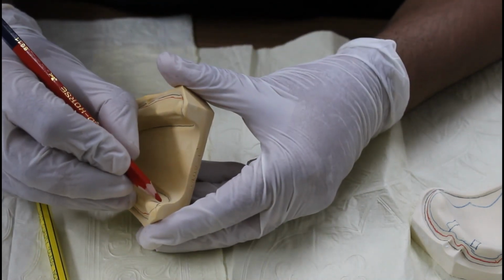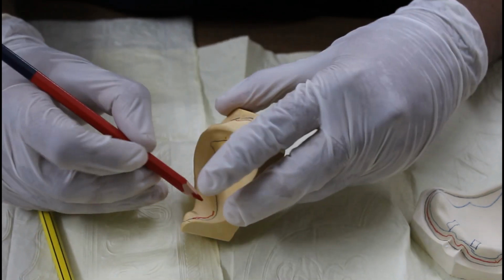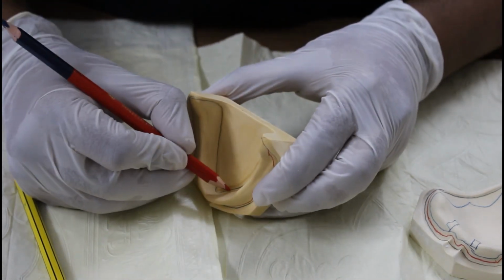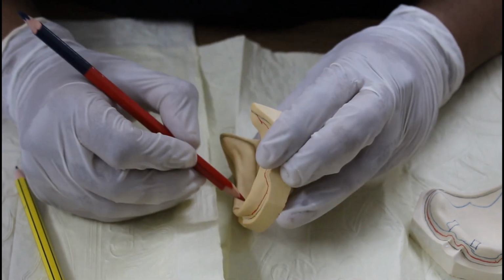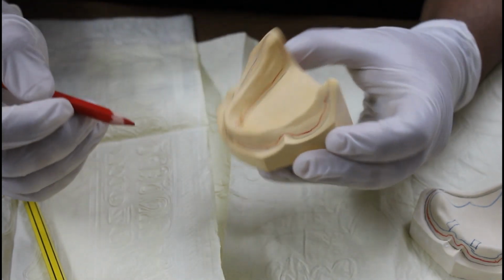Now come to the lingual side, join it here and make it 2 millimeter approximately above the first line. And join it in the retromolar pad.